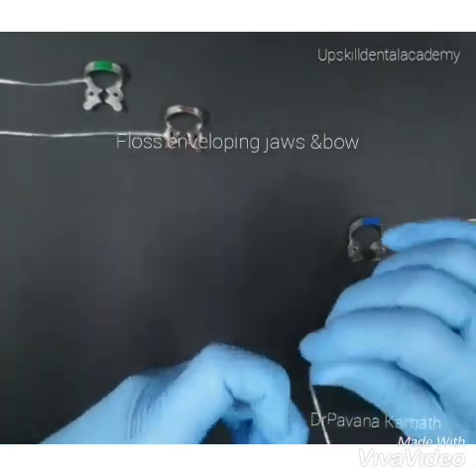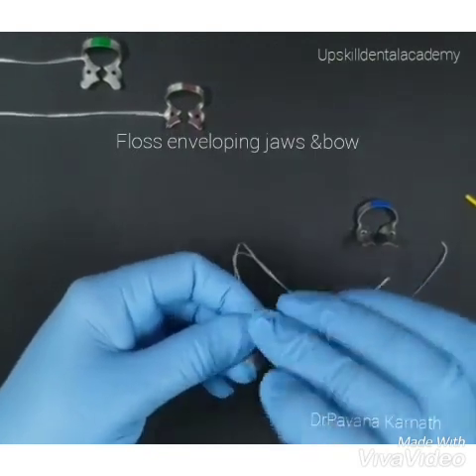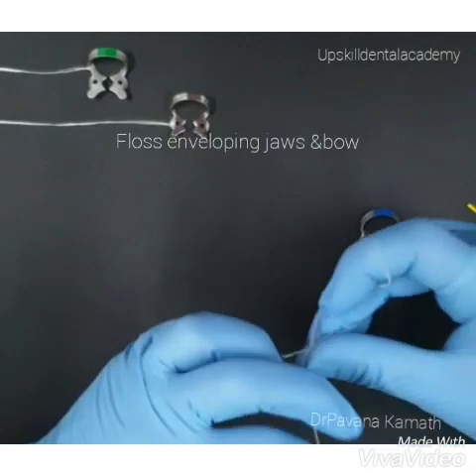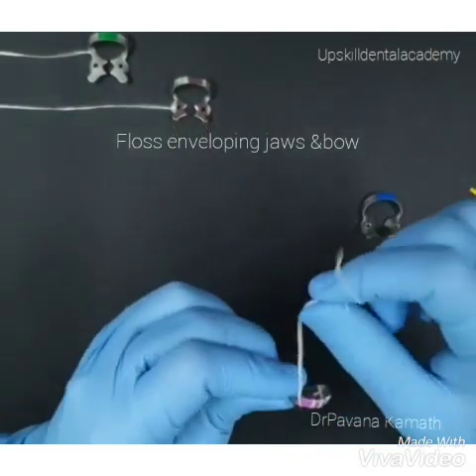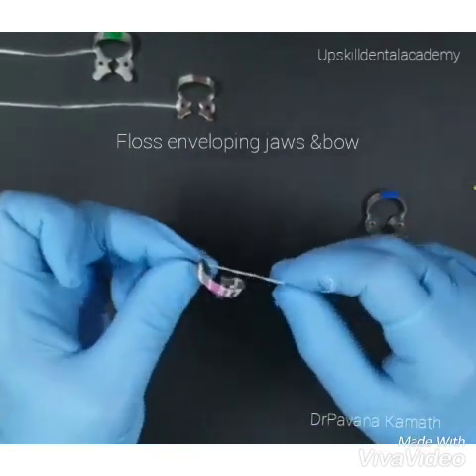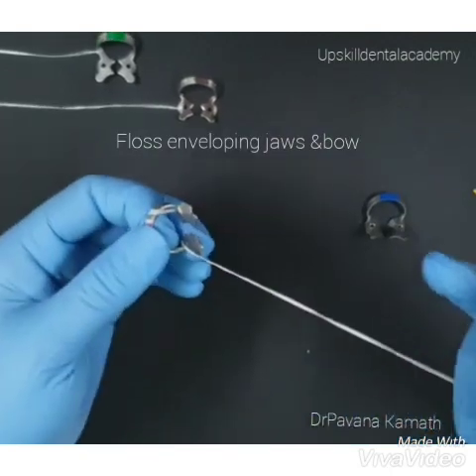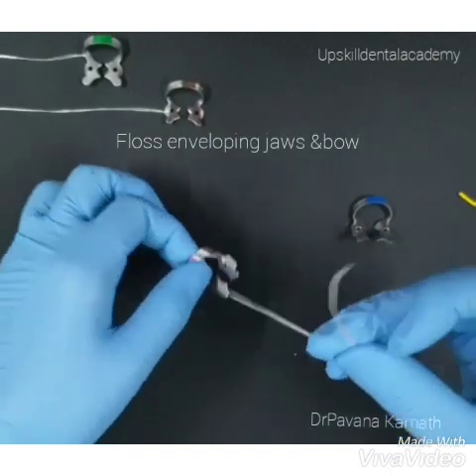adapting it closely to the bow so there are no free ends which could get entangled either in our instruments or anything else. You can see that it is being adapted very close to the bow, no free ends, and then it is again secured with a knot on the buccal jaw, and the free end of the floss is released extraorally.